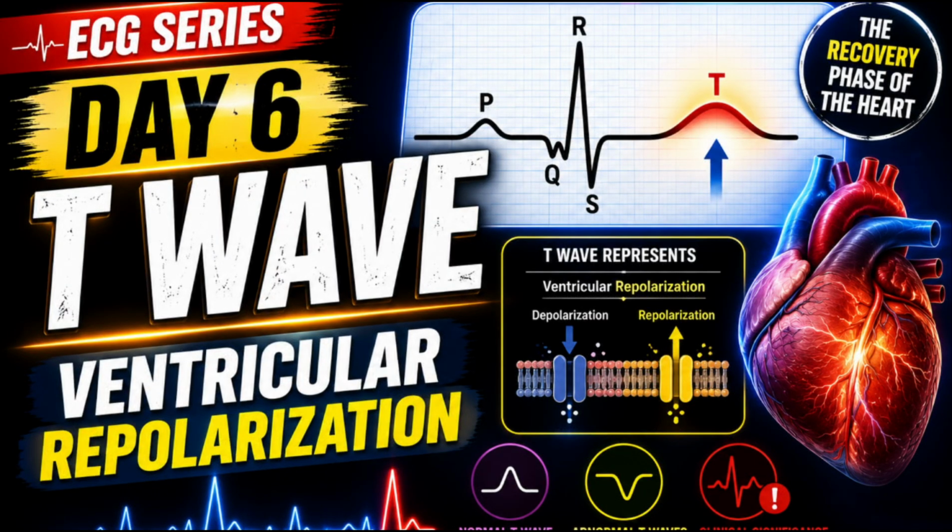So far we have learned day 1 ECG basics, day 2 about P wave, in day 3 we learned about PR interval, day 4 about QRS complex, and day 5 ST segment. So today, in this day 6, we are going to learn about the T wave, one of the most important ECG components for diagnosing ischemia, electrolyte abnormalities, and life-threatening cardiac conditions. So without time waste, let's begin.